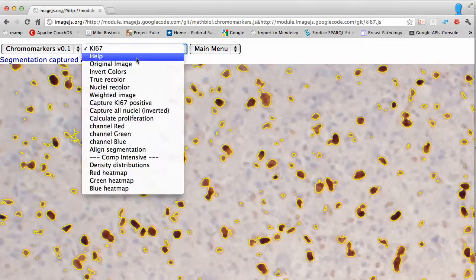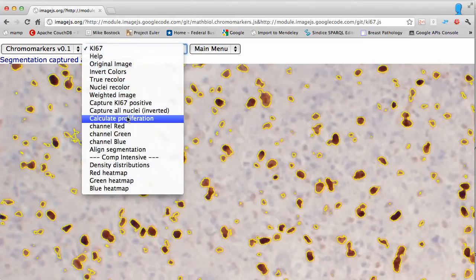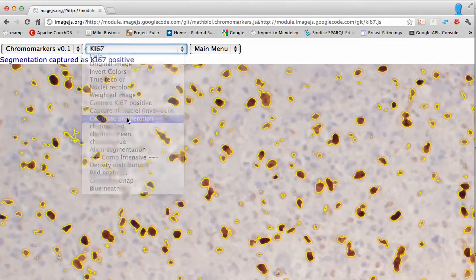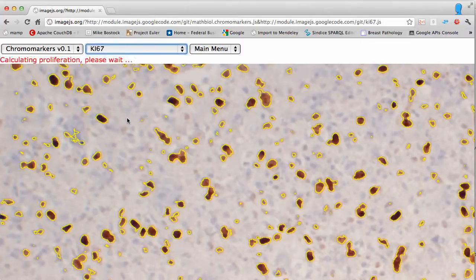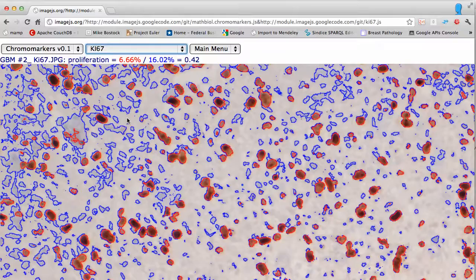Now you can calculate proliferation and get a result that is well represented here, with documentation of why and how this value was calculated.